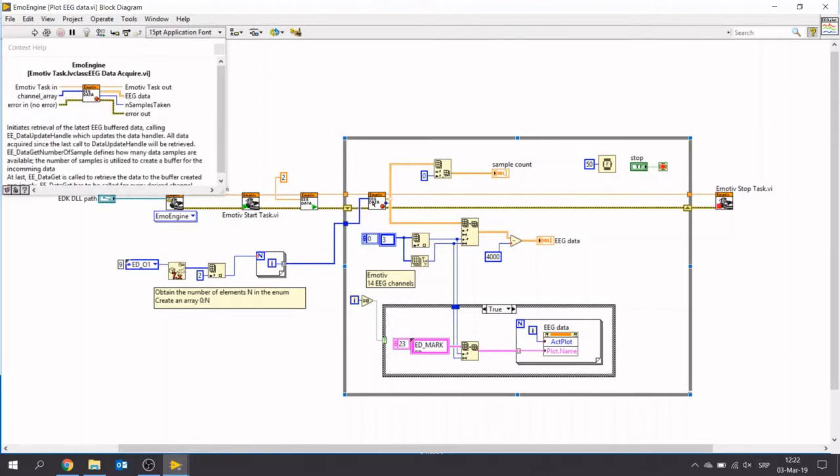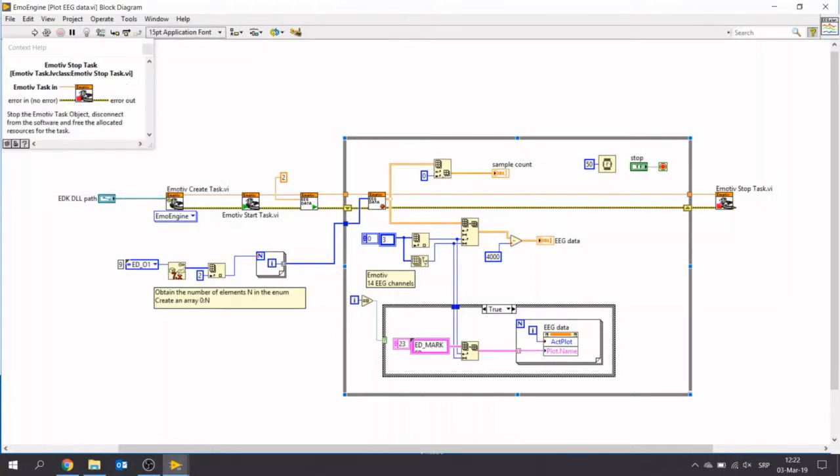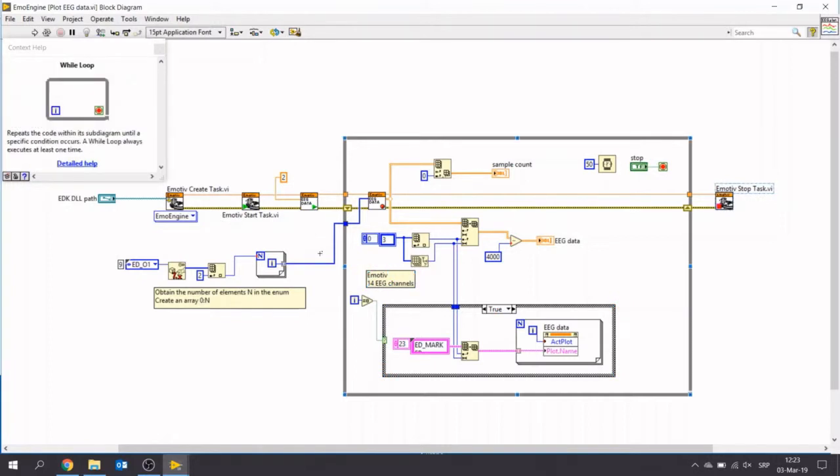In the while loop, we have this acquire data block. So in this block, we are collecting or reading the data from the Emotiv that is in the buffer and clear the buffer. After the while loop, we have Emotiv stop task block that is used to stop the task and free allocated memories and so on. Okay, so this part of the program tells us how many channels our device has. In this example, we have 14 channels for EEG, and that is how much we are going to read in our while loop.